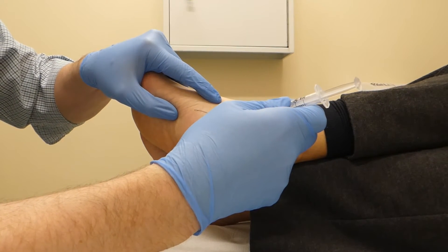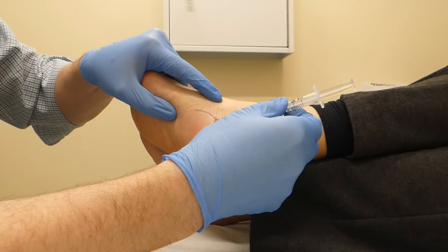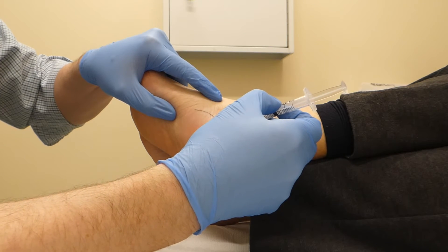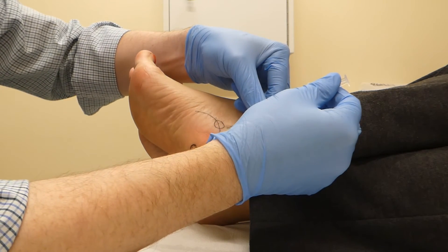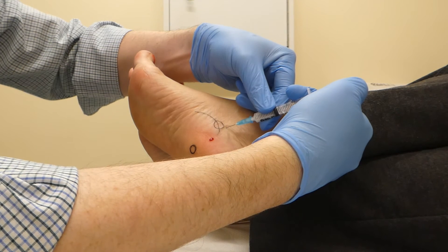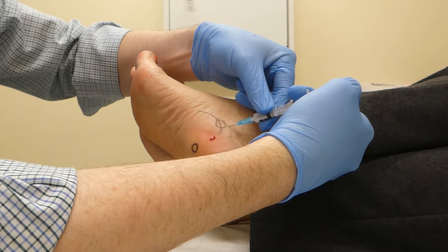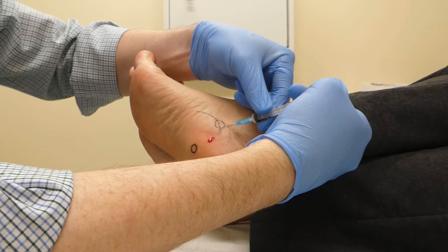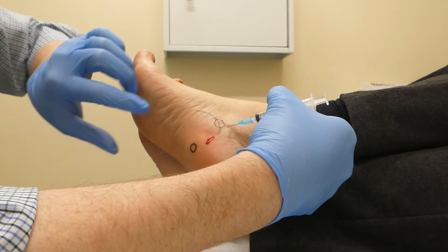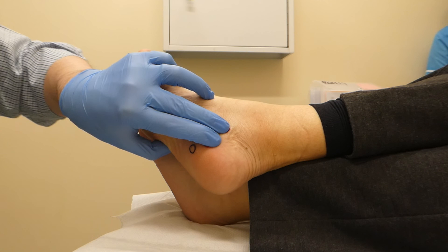Second point, Nicky. Three, two, one. Out. Oh hello — that's great at this point. A little sting going in there. Yeah, that's the right spot. Sorry Nicky, sorry. Nearly done. Okay, out we come. And then of course somebody comes in, as always, when we've got the video going.